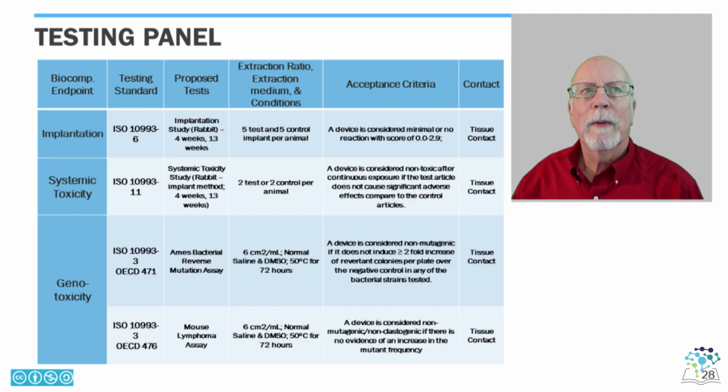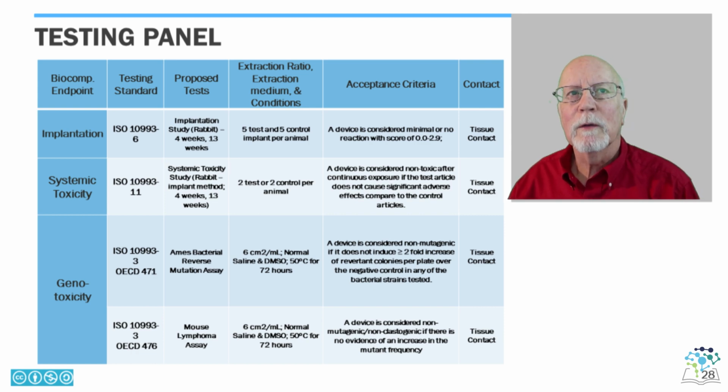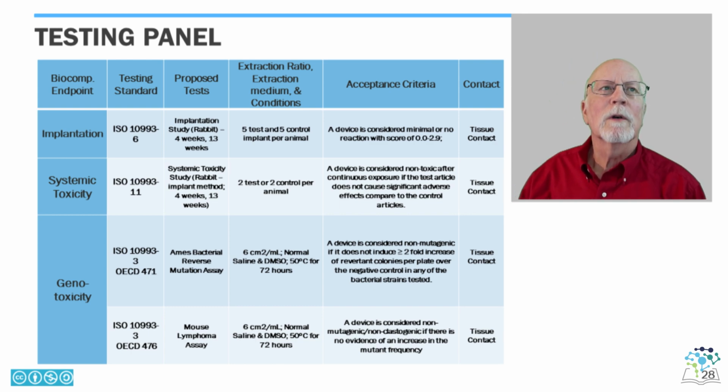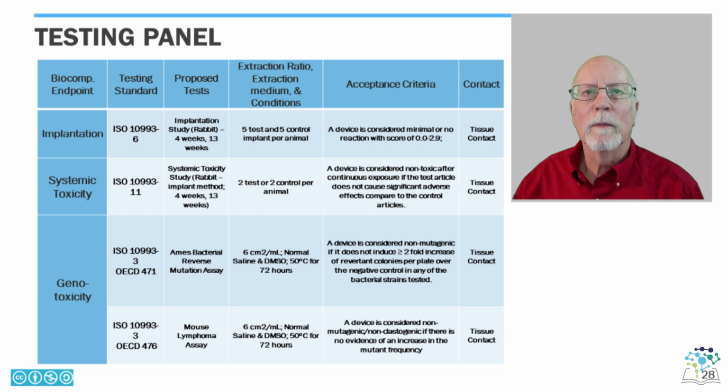This continuation panel lists the more complex, rigorous, and longer duration biological assays, which are also frequently utilized for well-characterized devices to assure compliance with this set of standards. The longer duration and implantable components of our device would all require these tests be performed as well.